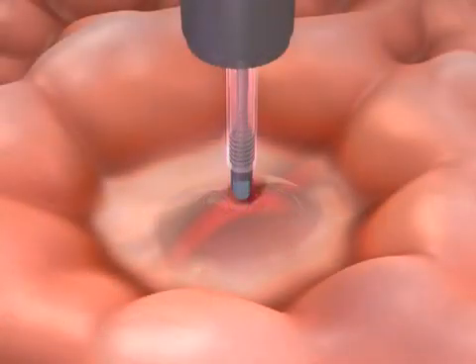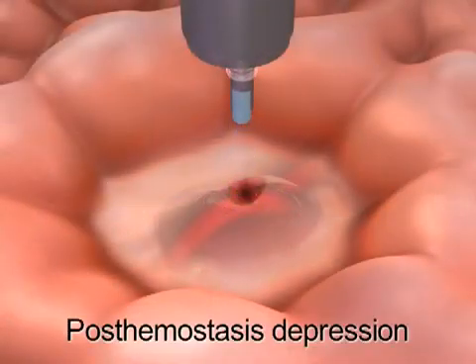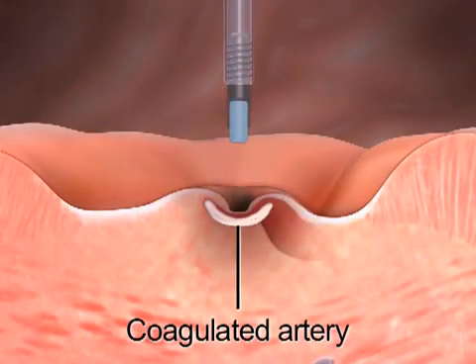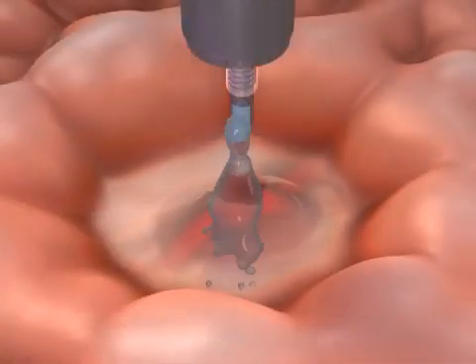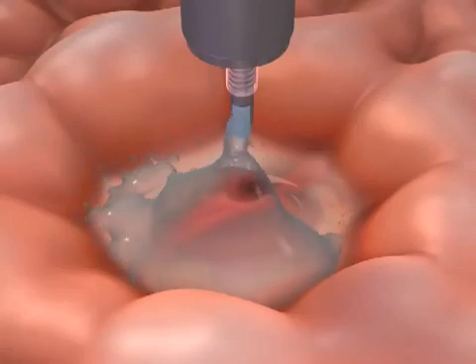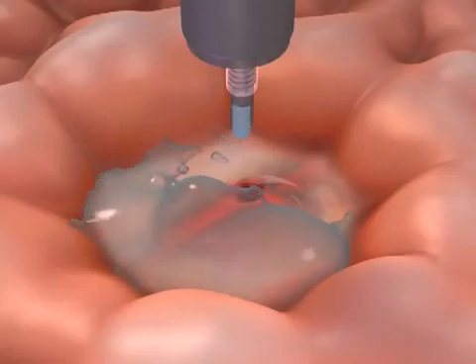The endoscopist should observe a post-hemostasis depression or footprint on completion of the contact thermal therapy, confirming the approximation and fusion of the superficial tissue layers and the deeper tissue layers. This area then should be irrigated with water through the contact thermal probe and observed for any possible post-treatment bleeding.